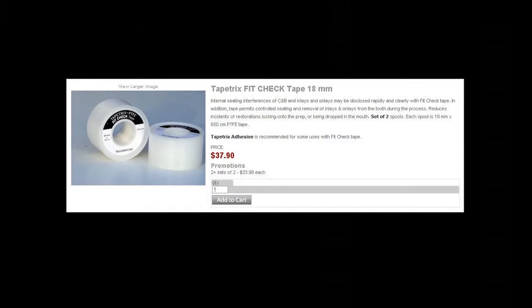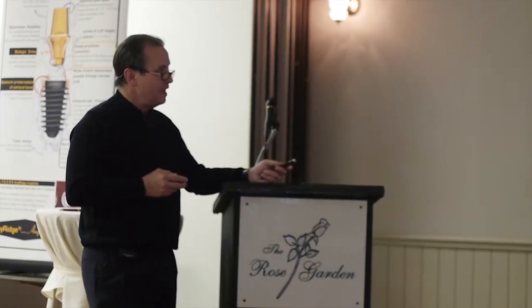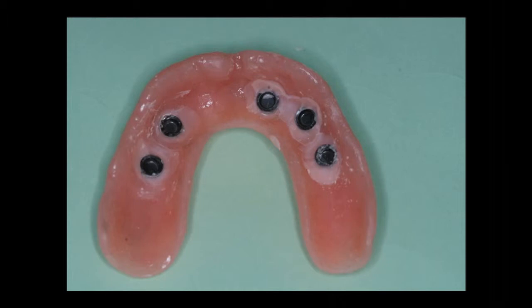And you can buy this stuff. It's called Tape Tricks Fit Check, 18 millimeters, $37 for plumber's tape. Or you can go down to Ace Hardware and get it for like $1.50. It's the same thing. It's just Teflon tape. And so now we've taken his denture loaded with acrylic. You can see some of the Teflon extruded through those vent holes. And we're going to let this set up.